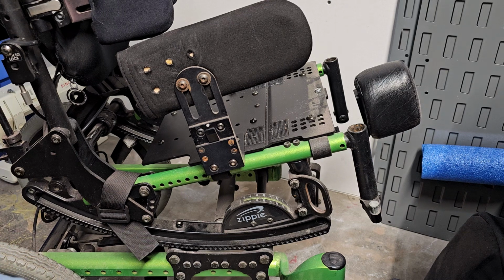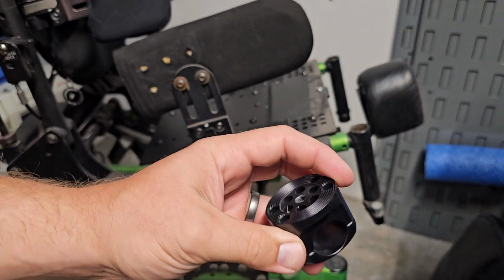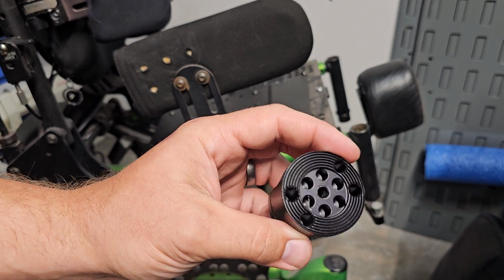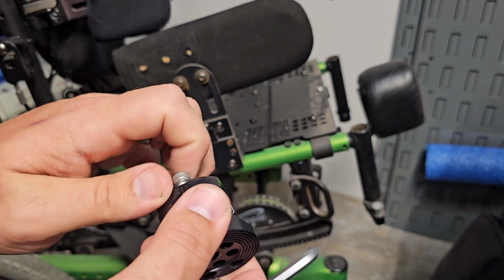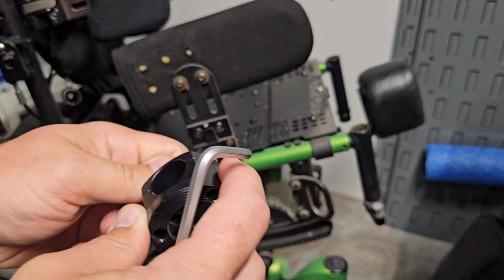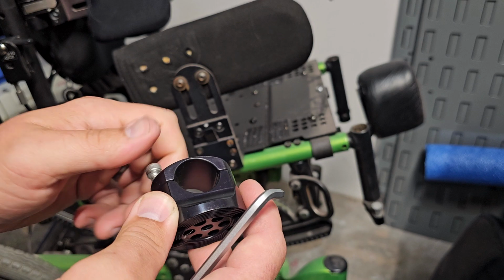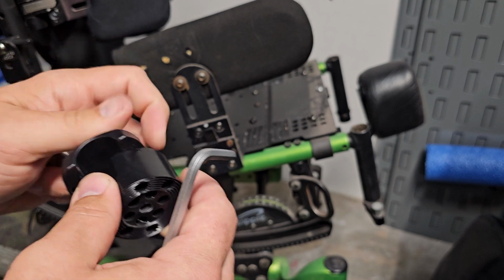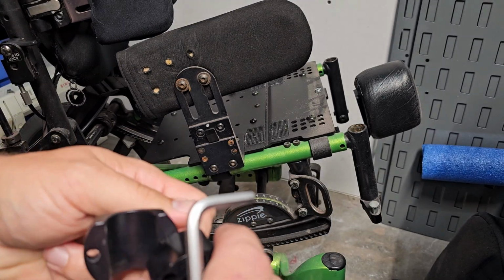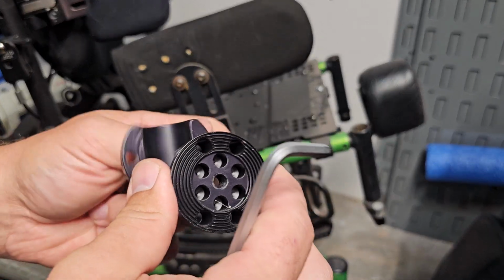The one that we'll be using today, and I'll go through the mounting process, is this one. This one I find to be better for long term. I use this one and I just leave it on the wheelchair. I don't take this on and off after every use. So with this one, just take the bolts out, and again, find where you want to mount it, and then you put the groove and hole side out.